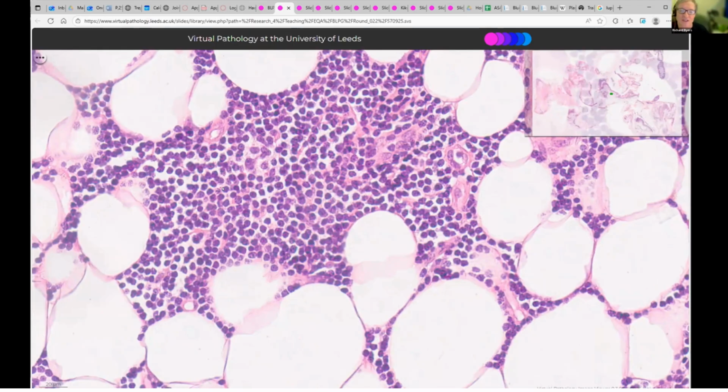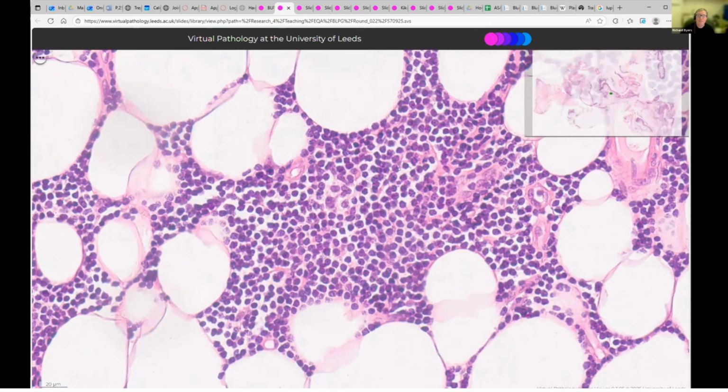What do people think this is? This is a good field here, just here, with some small, slightly irregular cells and some, not many, but some larger cells. So just checking. Okay, I think Venkatish, I think your answer is great. A low-grade non-Hodgkin lymphoma. It's always important to be correct. So yeah, I think it's low-grade NHL. Okay, Jay says query CLL.